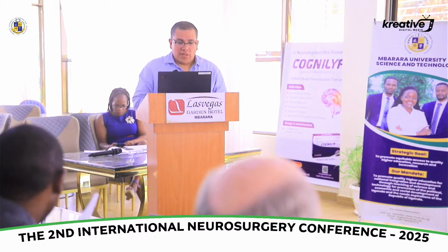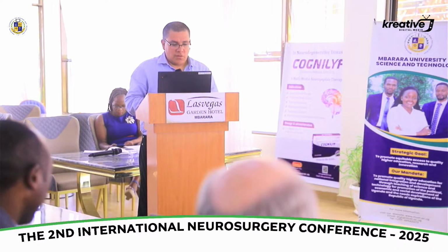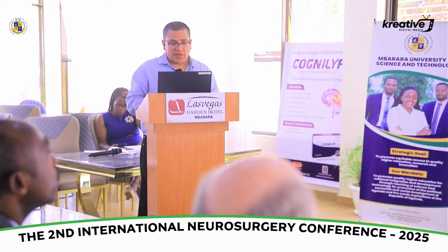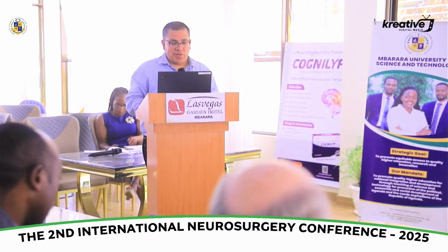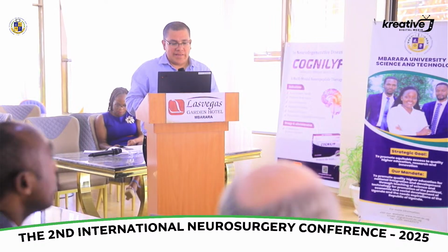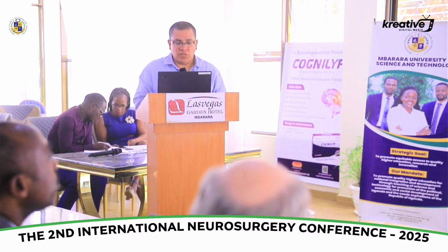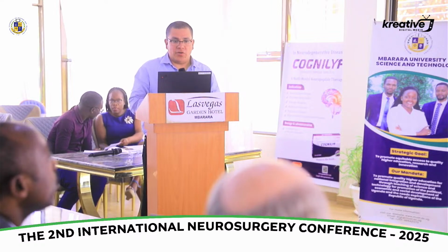So this is what the ultrasound with transcranial Dopplers looks like, describing the intracranial vasculature. You can see the circle of Willis. You can see both MCAs, you can see the ACAs, the ICAs entering the skull as well. This is an easy-to-do ultrasound in a pediatric patient, a neonate.